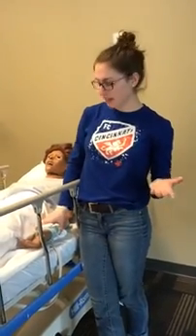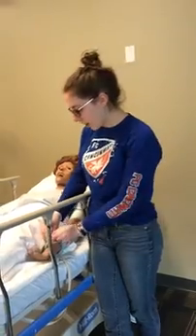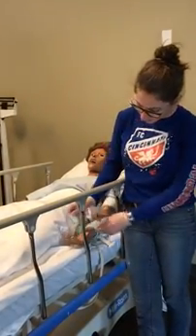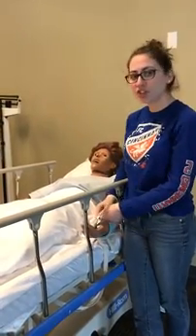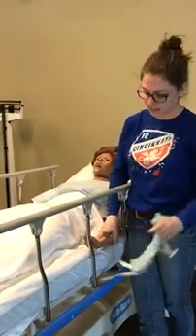And then with restraints, you need to check on your patient every hour just to make sure they're still tied or they didn't get loose or something. And then every 2 hours, you're going to take them off. So I'll just take it off, and you would check for skin integrity and just assess the range of motions and make sure they could do their ADLs, activities of daily living.